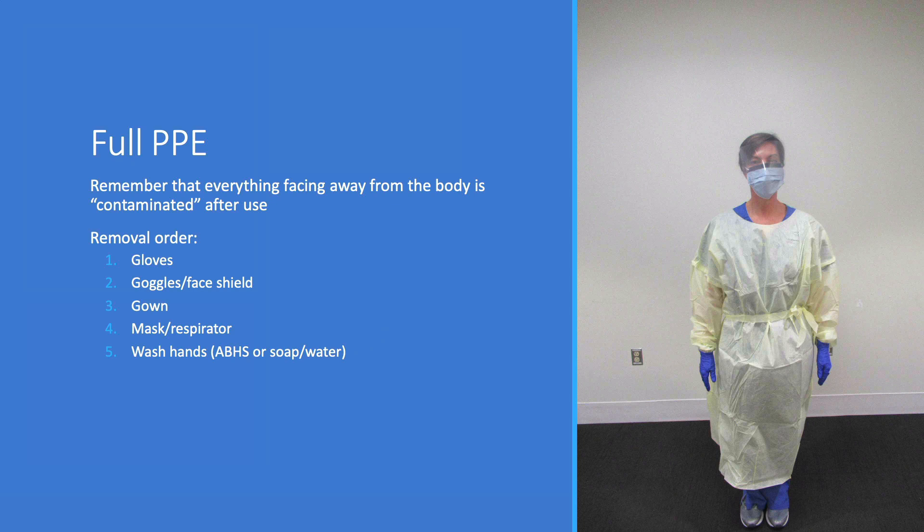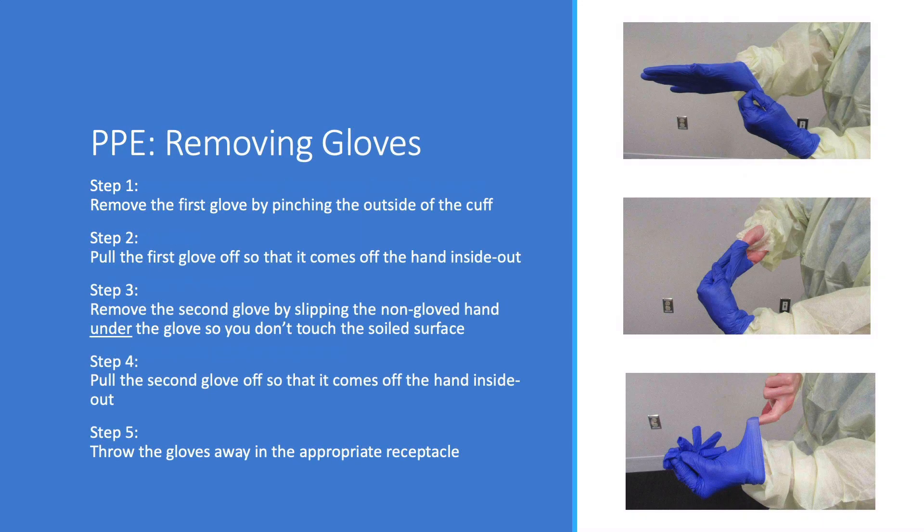This is key when we need to remove the gear. We'll remove the gloves first. Note that the respiratory therapist removes the first glove by grabbing the dirty side of the glove to pull it off inside out. She then puts a non-gloved finger under the second glove to remove it in the same way, not touching the dirty side of the glove.